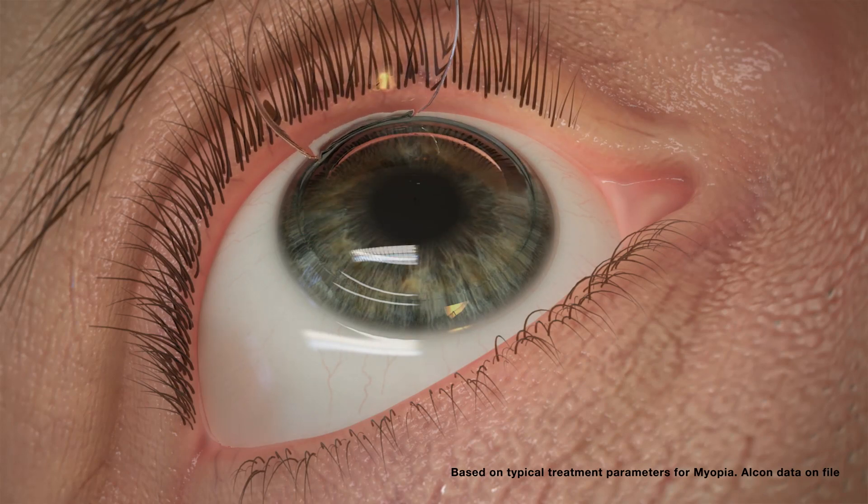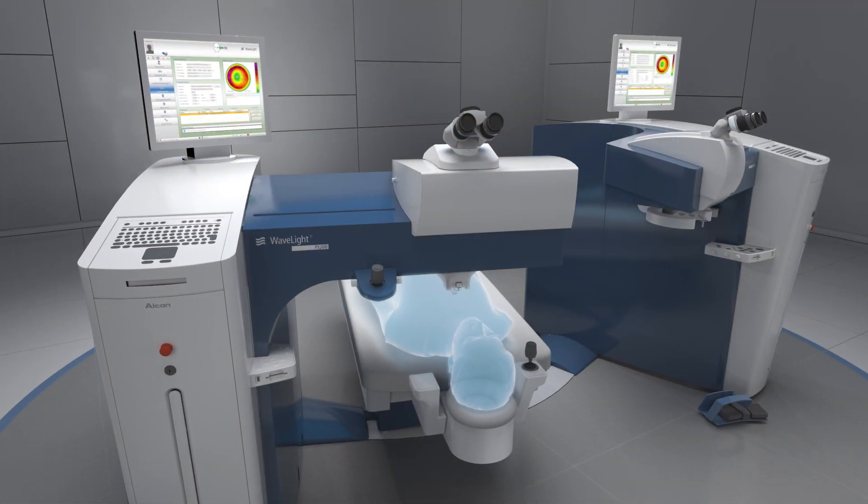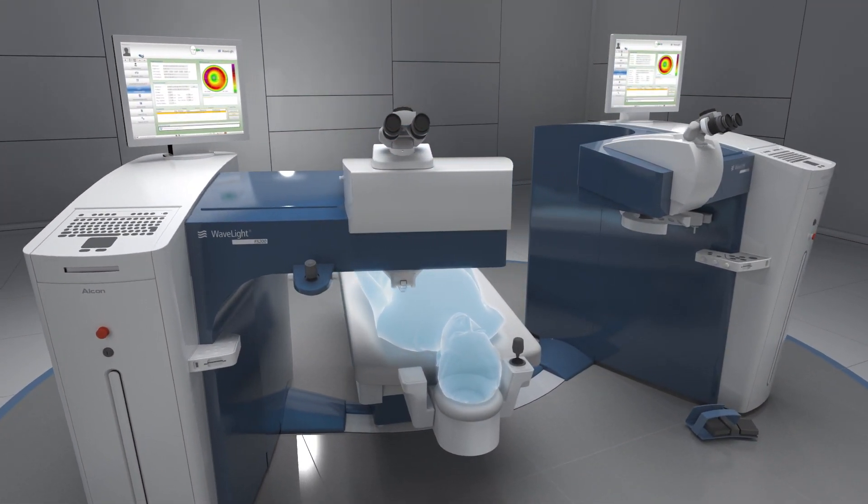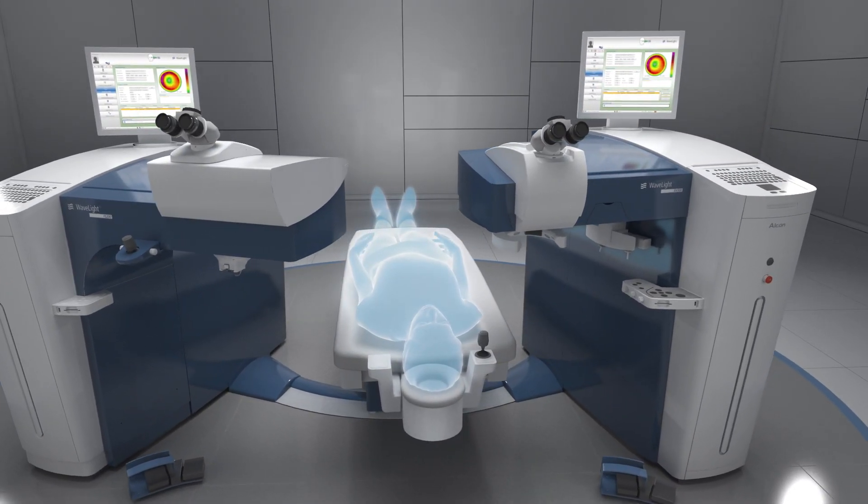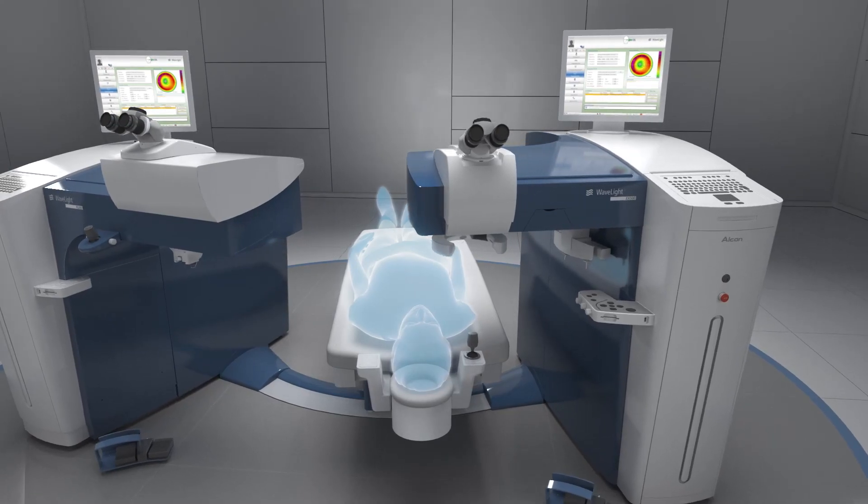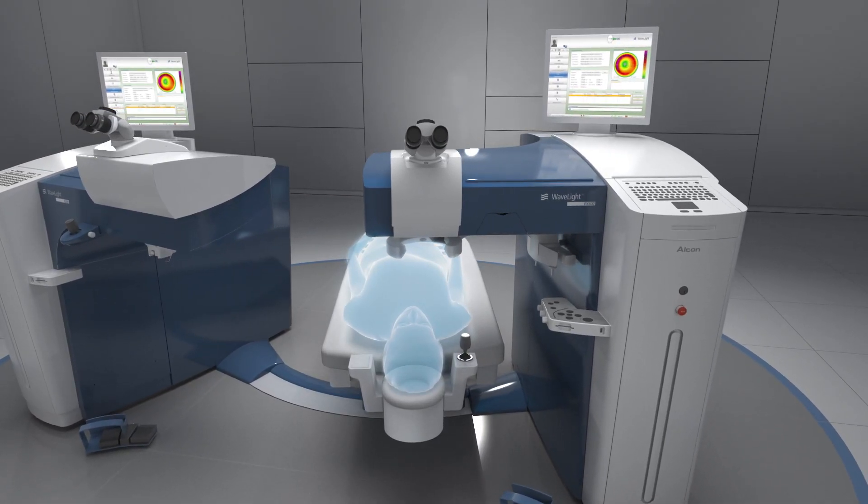The patient bed moves to the EX500 for the next stage of treatment. With only a single data entry point, the margin for error decreases while customization capabilities increase.